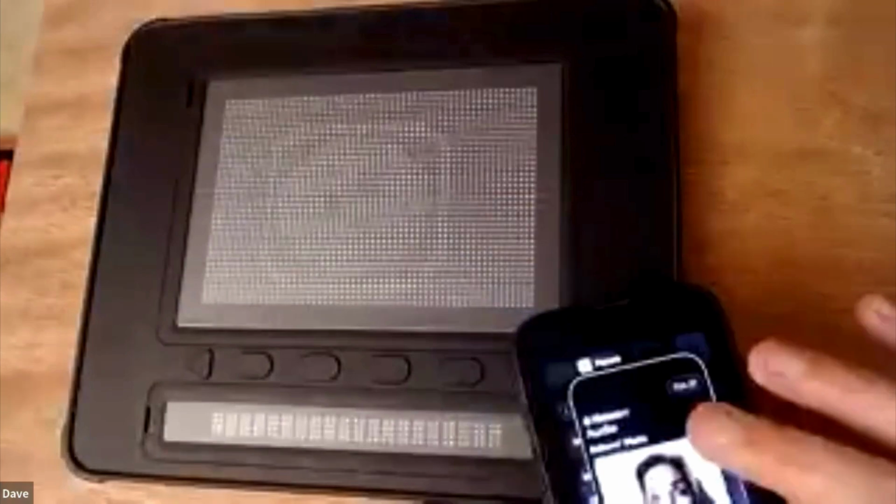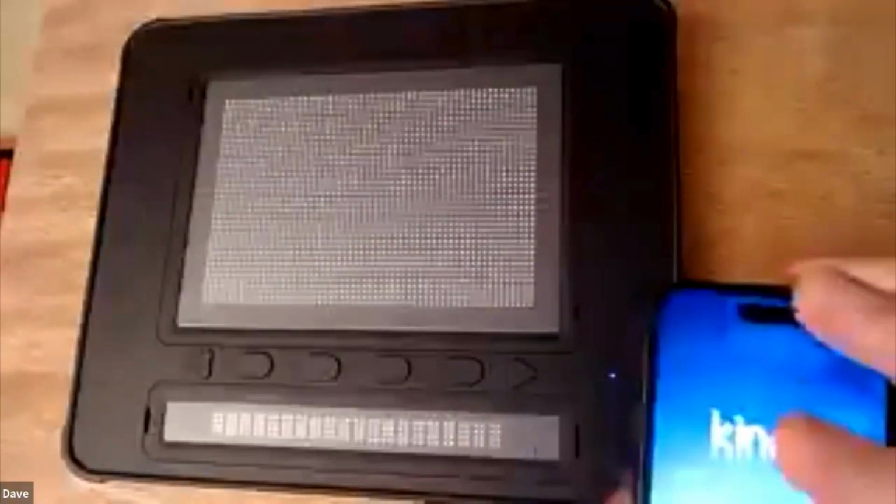Okay. The last thing I want to show you is my book. I say my book, the book I'm reading. I haven't written one, you'll be relieved to hear. Here we go. So I can jump into Kindle here.